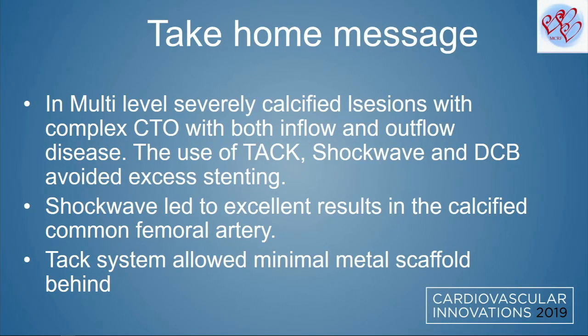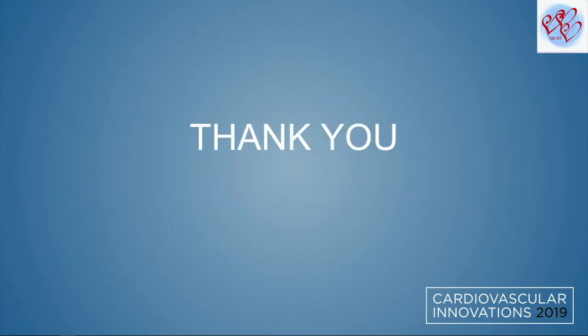So finally, the take-home message from this case: in a severe multi-level, severely calcified disease with a CTO, the use of Shockwave, DCB, and TACK system have avoided excess stenting. We only had to stent the iliacs, which are usually stented in most of the interventions. Shockwave, again, in the calcified common femoral had good results, and with the TACK system, we left minimal scaffold behind. Thank you.